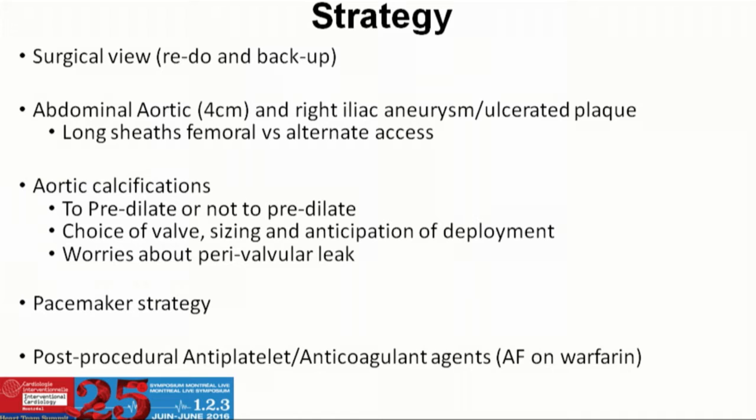Choice of valve, we certainly thought it would be better with the issue of the calcification to go with a CoreValve, but maybe people will have something to say about this. Worries about perivalvular leak is certainly a big point here. So I don't know about these three points if the panel has anything to say or any pointers for us at this point in time. Nothing is settled here, but I just told you about what our plan was. If the panel could give us some ideas, that would be great.